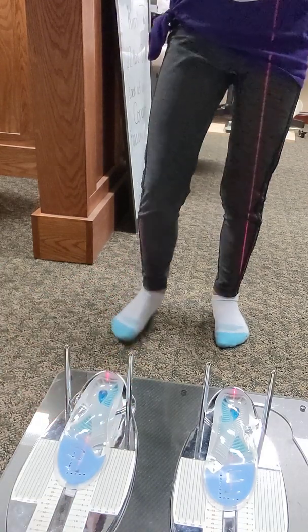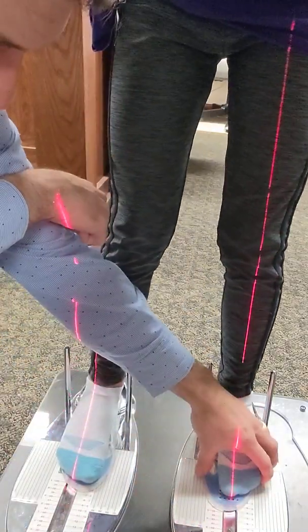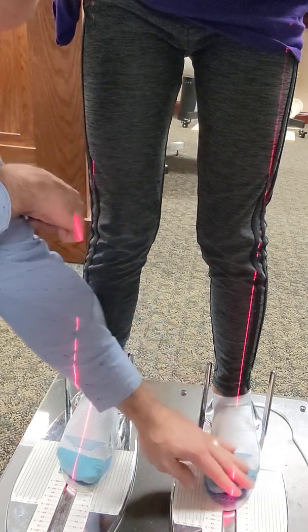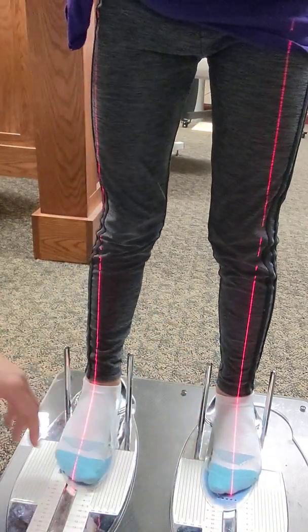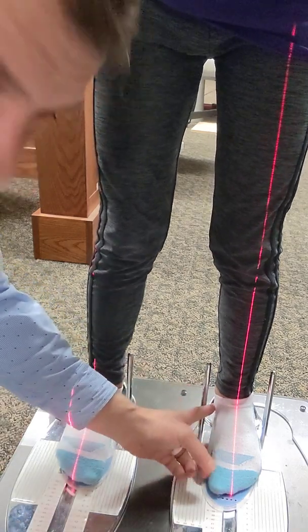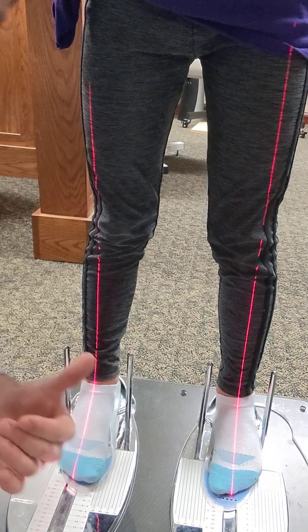Go ahead and step back on — second digit, nailed it — and then this one, second digit in the gap. So when you look at it, we see a little bit of improvement. She stands neutral. We're starting to see that talus come away from the post here, which is good. That's a good start.